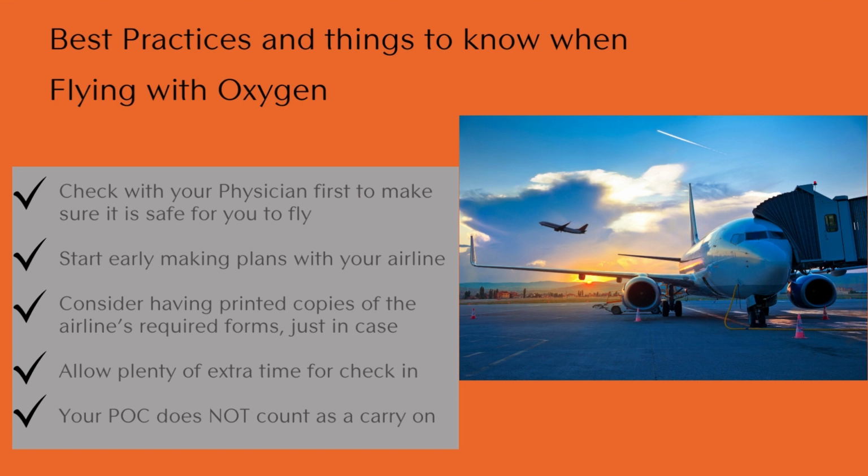Second, start making plans with your airline early. Later in this video, we will share some of the guidelines for some of the most common U.S. airlines. Third, if the airline requires forms or documents, consider printing those out to make it easier to show if needed. Make sure to allow plenty of extra time for check-in. Many airlines allow those needing extra assistance to board first, so that you can get settled on the plane with your equipment. Finally, airlines do not count your POC as a piece of carry-on luggage, so no need to worry about that. It may, however, make sense to check your bag so you have one less thing to worry about. You may also want to ask for wheelchair assistance to the gate and/or aboard the aircraft.